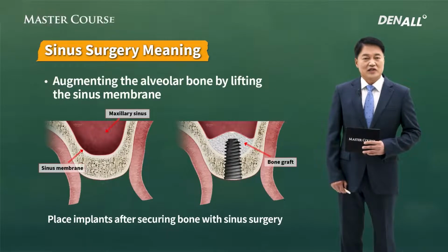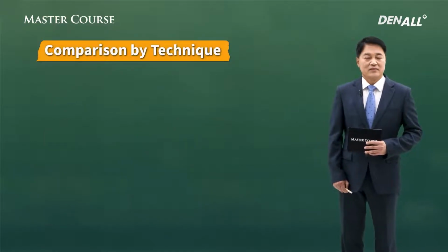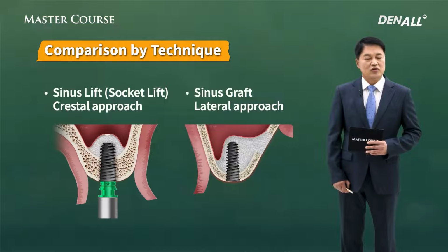Sinus surgery means lifting the sinus membrane and augmenting the alveolar bone. The bone that is achieved will support the implant. That is the sinus surgery. Let's compare the techniques. It can be divided into crestal approach and lateral approach. Let's look at the terms.